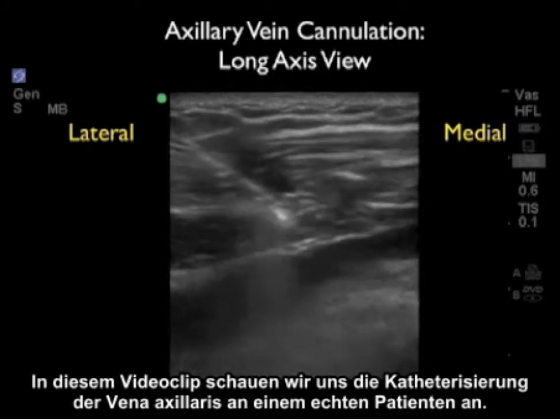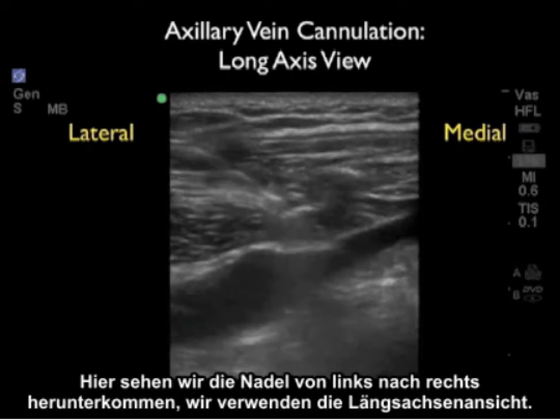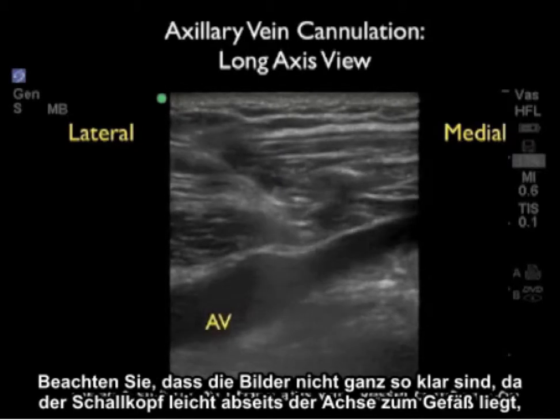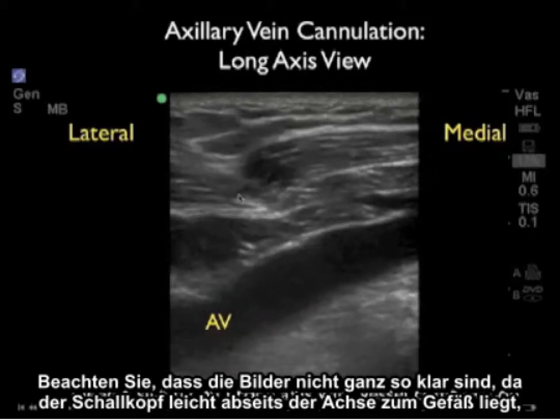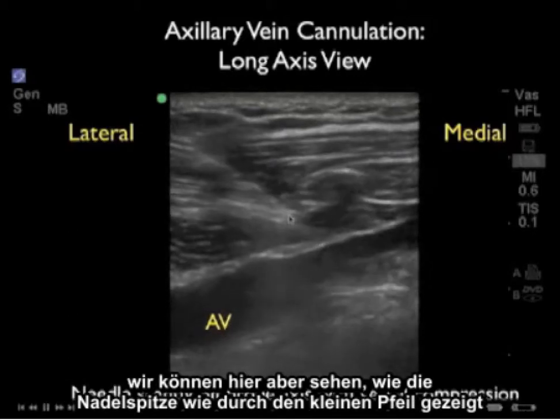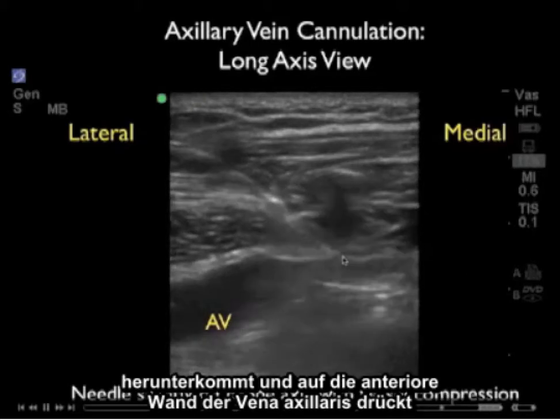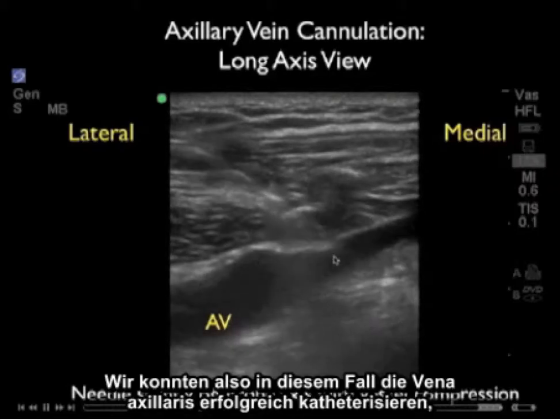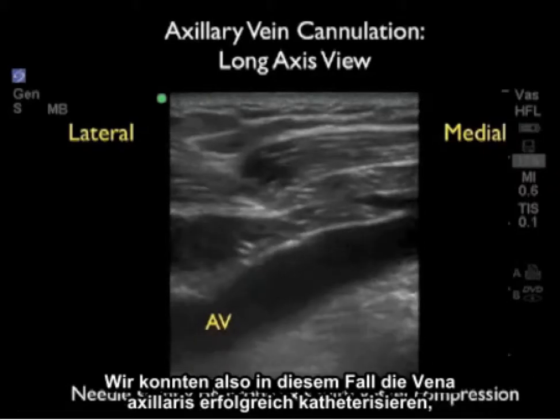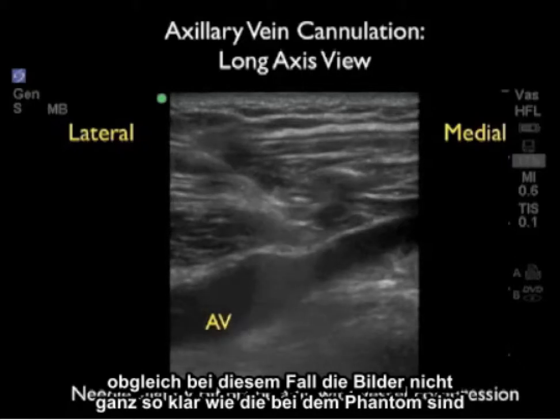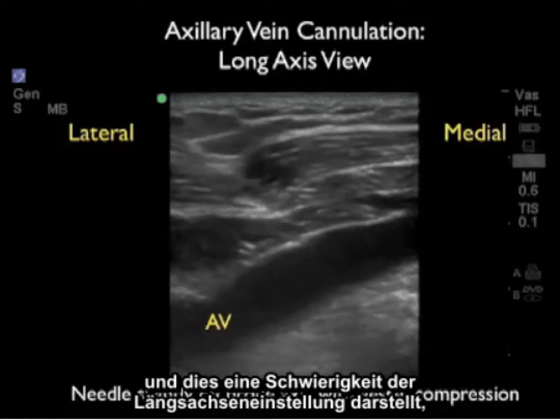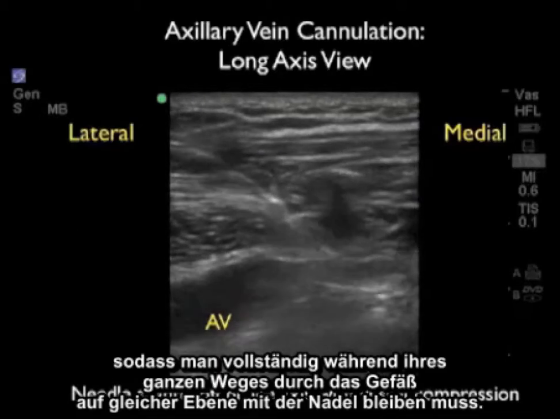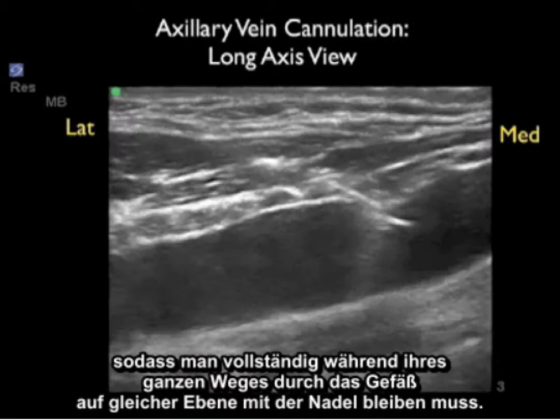In this video clip we watch a real-time axillary vein cannulation in a real patient using the long axis view, with the needle coming down from left to right. The images are not as crisp because the probe is slightly off-axis to the vessel. We can see the tip of the needle — indicated by the small arrow — pushing down on the anterior wall of the axillary vein and then entering the vessel lumen. We successfully cannulated the axillary vein, though images are less clear than in the phantom. A key pitfall of the long axis approach is that the needle must remain completely in-plane throughout its entire path down to the vessel.